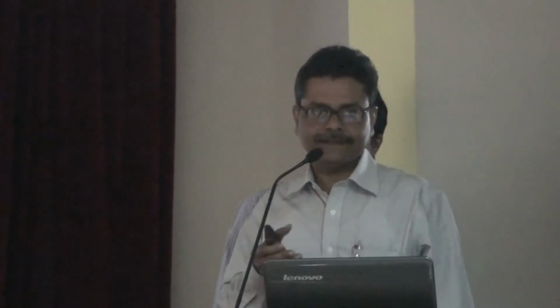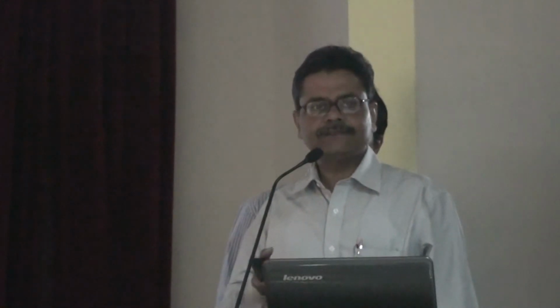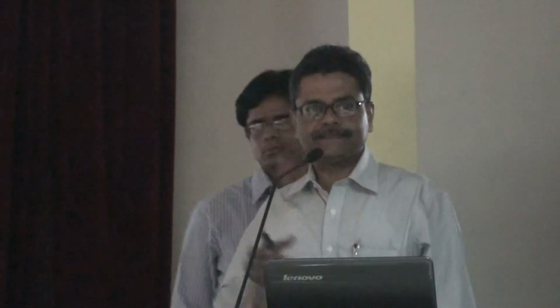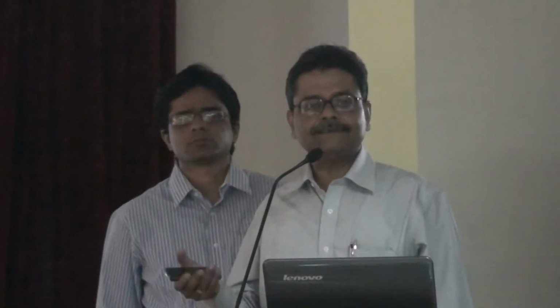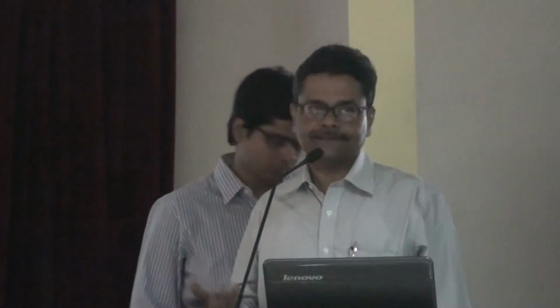And this should be available not only in ICU or SICU, this should be available in fact in most of the high dependency areas and the wards as well. Because while shifting a patient from a ward to ICU or SICU may take maybe a couple of hours in our setting, if you lose that time, then possibly the effectiveness will also be lost.